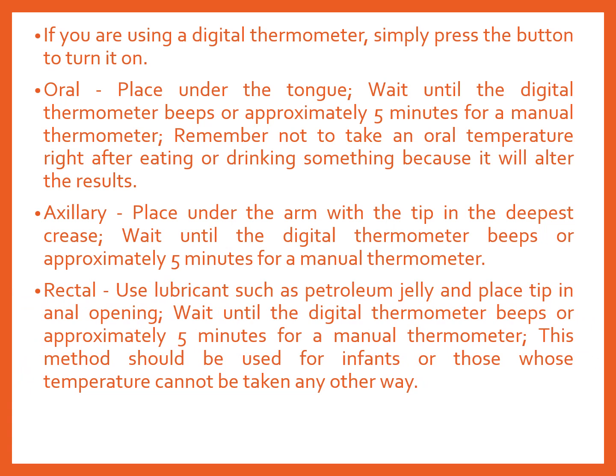Rectal: you need to use a lubricant such as petroleum jelly and place the tip in the anal opening. You don't need to insert the whole thermometer, just the tip. Wait until the digital thermometer beeps, or approximately 5 minutes for a manual thermometer or the mercury thermometer. This method should be used for infants or those whose temperature cannot be taken any other way.